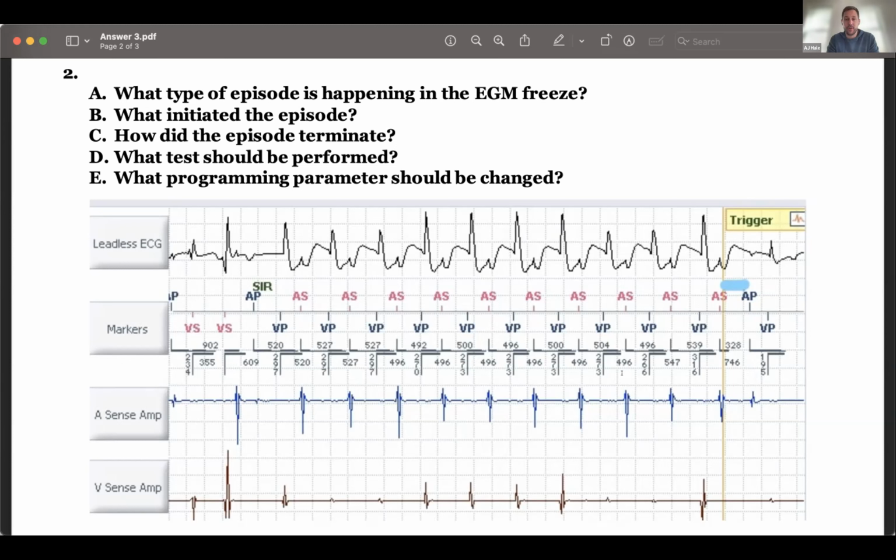It could be 90. In these instances, you may see patients that have otherwise good conduction, but a higher than normal ventricular pace burden. That indicates they may be having PMT, and it's something worth looking at. So you do your retrograde test, you VVI pace, and you watch the atrial channel to see that retrograde occur. Keep in mind, if their own atrium is going faster than your VVI pacing, you're not going to be able to see it. You have to go fast enough to overdrive. If their atrium is going 80, you need to at least do VVI 90. I usually do 90, 100, maybe 110, but 90 to 100 is about as fast as I'll go. I'll measure the retrograde timing, how long it takes to get from the ventricular pace to the atrial sense, and then set your PVARP timing to cover that.